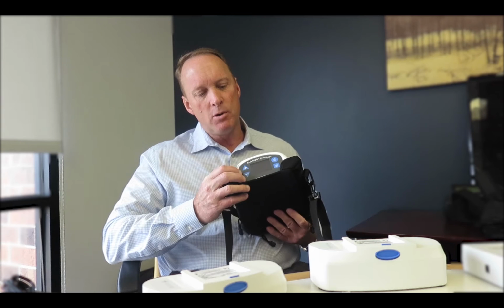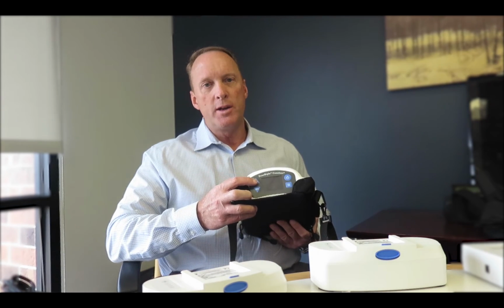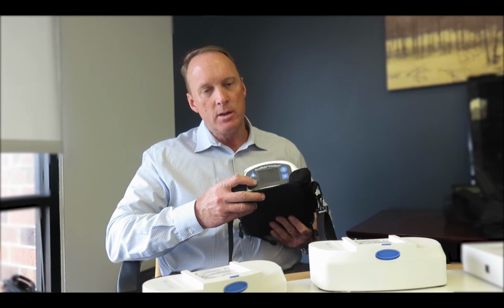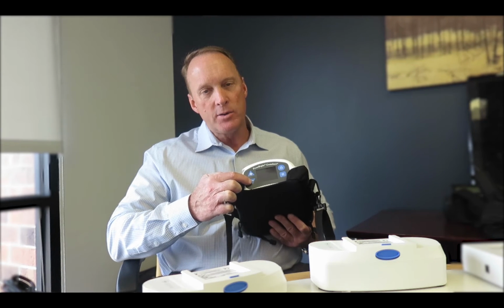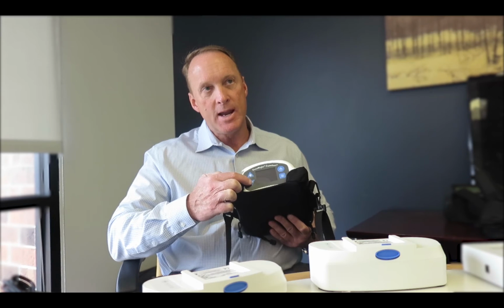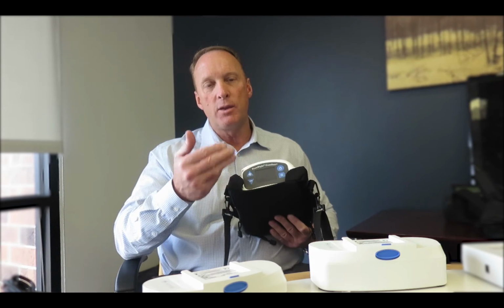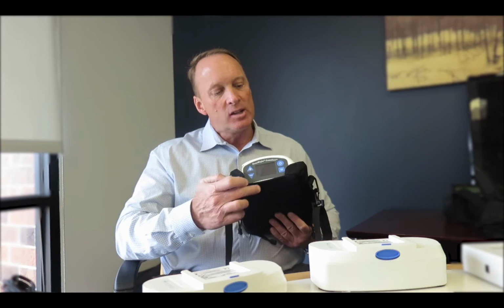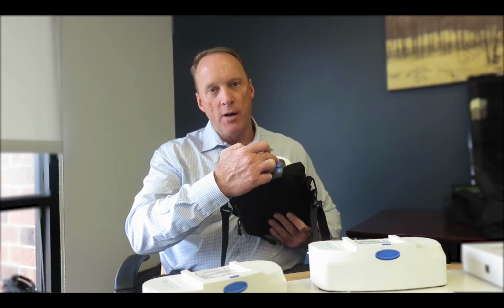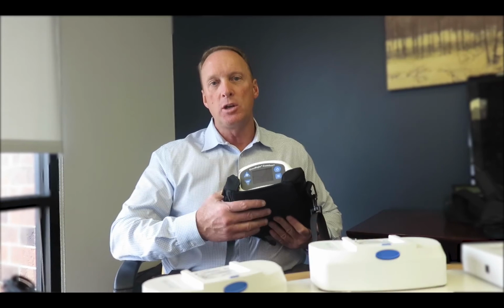To put it in test mode, you have an up and a down arrow key here. So to put it in test mode, all I do is press the up key twice. So up, up, down, down, up, down, up, down. So again, up, up, down, down, up, down, up, down. And that will put it into test mode. You'll be able to see on the display the three graphics I just mentioned. And then to get it out of test mode, all you do is turn the unit off and then turn it back on again, and it resets it right back to the clinical mode so the patient can use it.